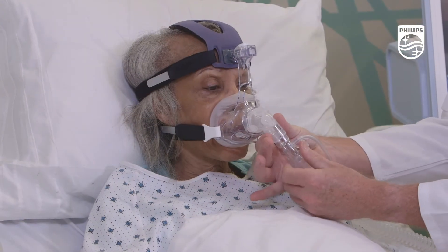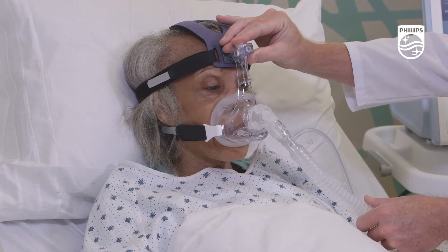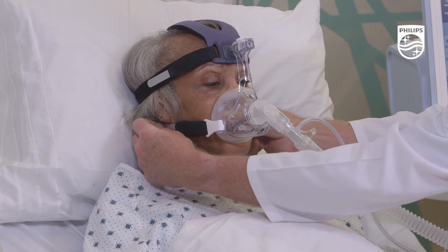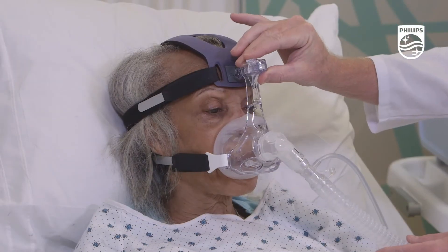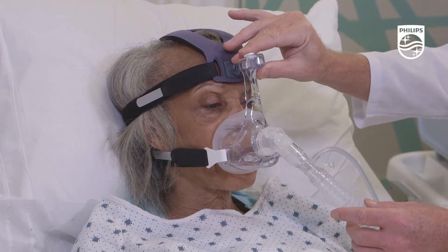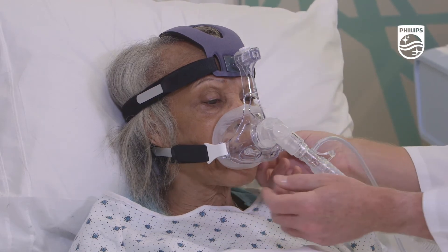After that, you are ready to connect the circuit to the mask and customize the fit by adjusting the frame slider and then the lower straps. When you push the button on the top of the frame slider, you may adjust the position of the frame relative to the patient's face. This will help minimize leakage around the patient's eyes.